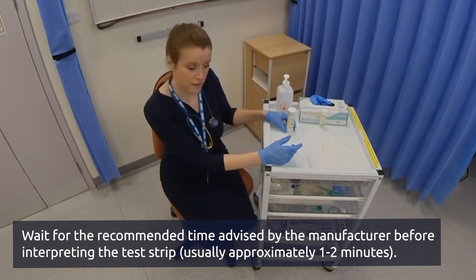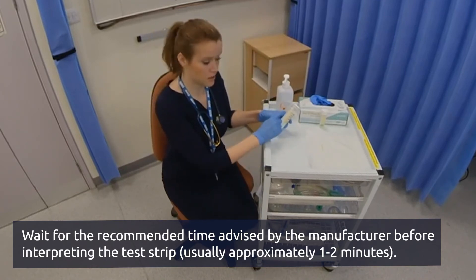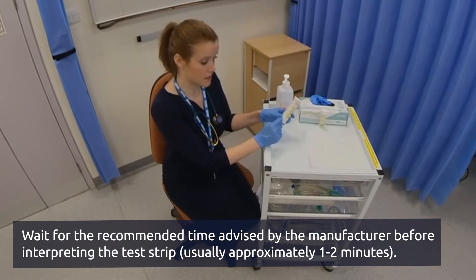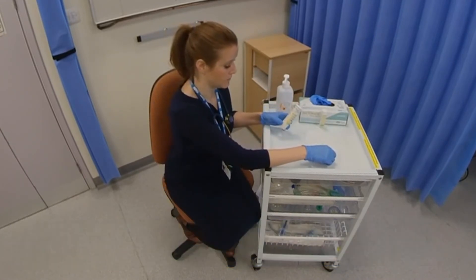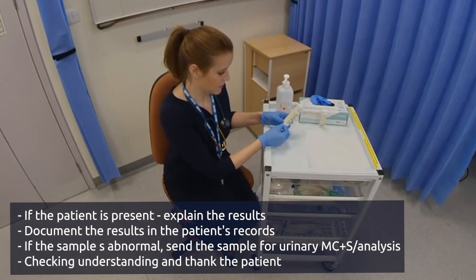Once you've waited for one minute, you then want to compare the strip to the index along the side of the dipstick bottle. You're looking at pH, protein, glucose, ketones, and blood.